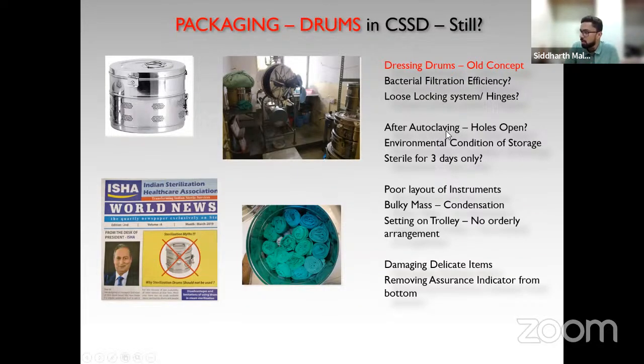So after autoclaving, if you keep the holes open for a very long time, and this is the kind of area where you are keeping your drums, you can be sure that it is not going to remain sterile, because the movement and circulation of air from here is going to bring in pathogens and take them inside the drum itself. In this kind of condition, the environmental storage time cannot be more than 3 days for sure. If you have a loose locking system, the hinges have been broken, or the flange is not opening or closing properly, the whole point of using a sterile system drum is lost. It's of no use actually.